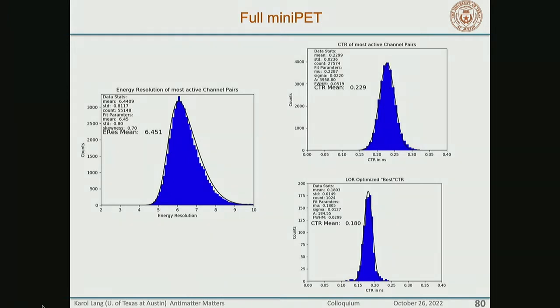If you recall, which you probably don't, the image that I showed of the commercial PET scanner, with no TOF and TOF, has 550 picoseconds. Why? Because at least until a few years ago, that was the industry standard. Nowadays, industry standard is closer to 300, I would say 350. If you go to conferences and hear talks from research groups which recently purchased the best PET scanners out there, they would tell you that that's pretty much what it is. So we are actually hitting numbers that are better than commercial systems.